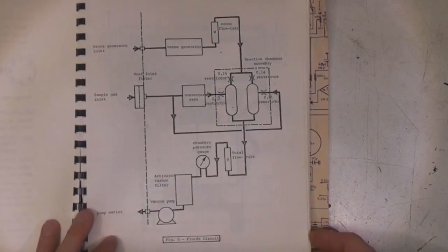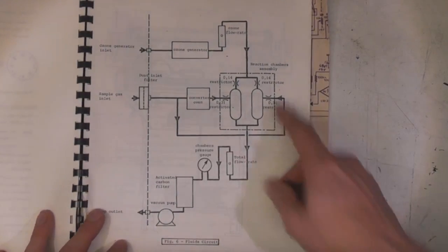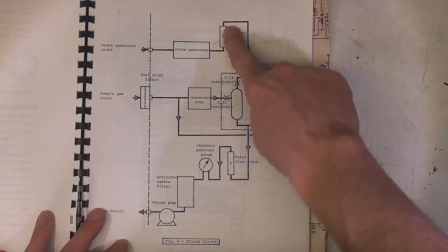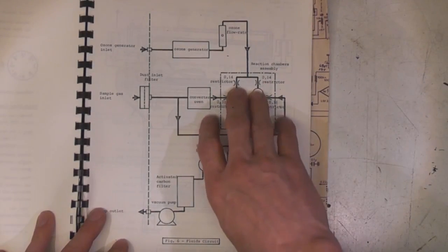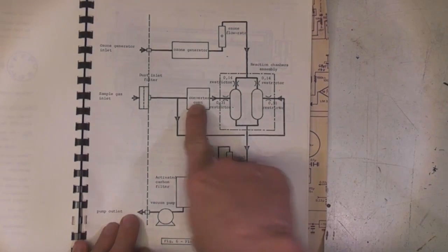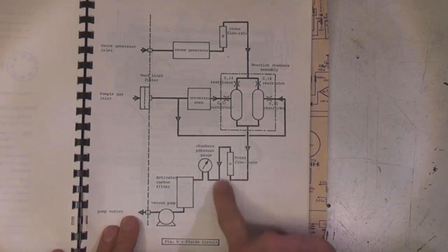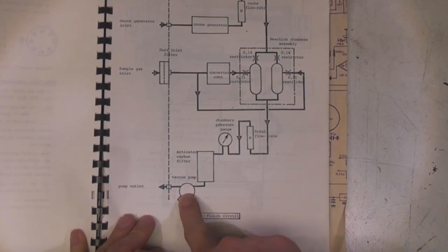This includes quite a lot of schematic details - this is the actual gas circuit. We've got an inlet to the ozone generator which I think is just filtered air, ozone generator, a flow meter, restrictions to control the amount of gas going through, then the actual reaction chamber, the sample gas going through one path through this oven, the other path going directly, another flow rate indicator, pressure gauges, a carbon filter and a vacuum pump to actually pull the gas through.